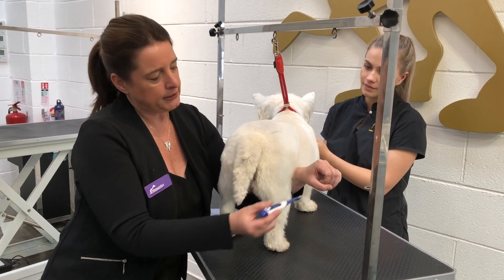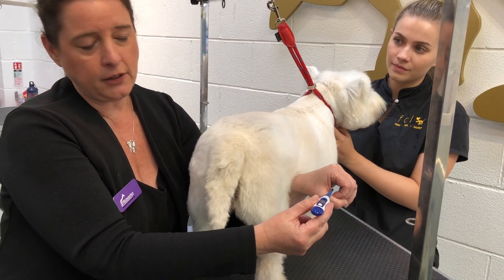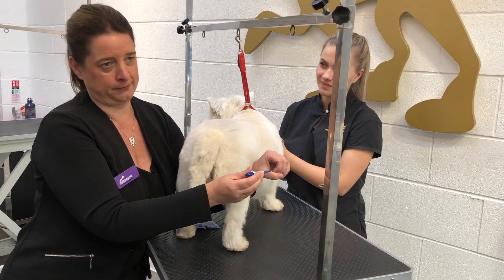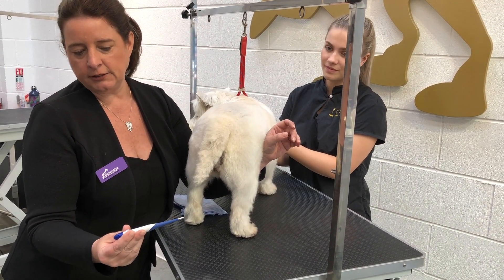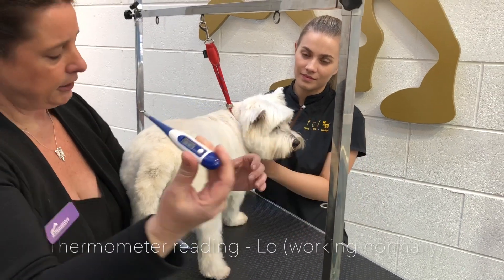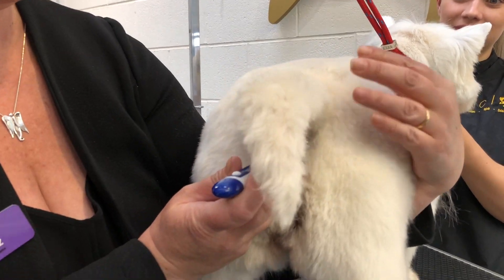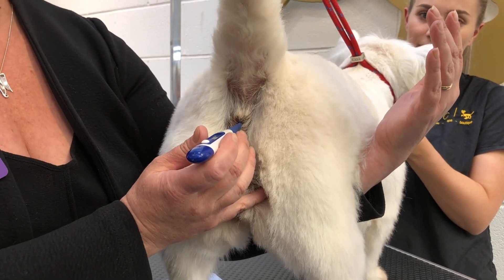When you actually put it in the dog's bottom — I'll show you now, pretend this is the dog's bottom — I'm going to put it at the side of the mucous membrane so it's actually touching the mucous membrane, not going in the middle. The reason for that is, as dog groomers you know what happens when you touch the dog's bottoms — sometimes they do that little pulsing and poo pops in and out, and I don't want to be taking the core temperature of the poo. So I'm turning it on and waiting for it to beep. It's gone to 37 and then to the ready sign. So I'm gently finding Chloe's bottom and inserting just the tip — she's trying to push me out, but I've only got the tip in and the dog didn't react.